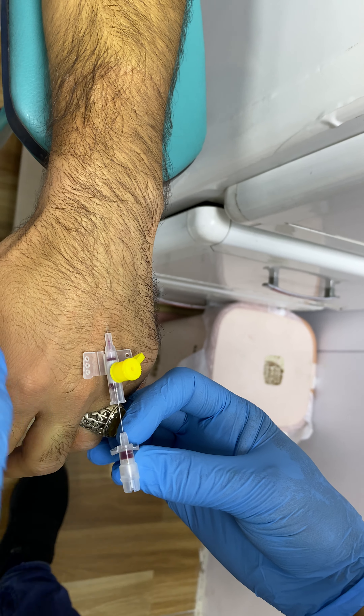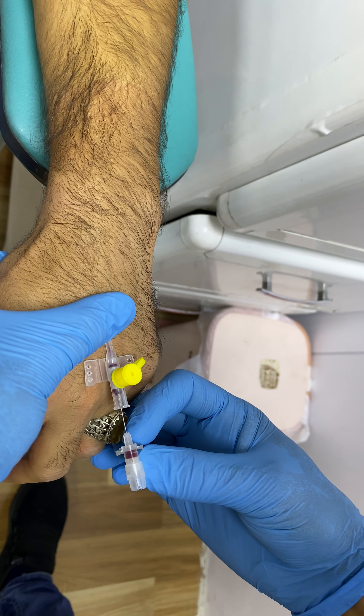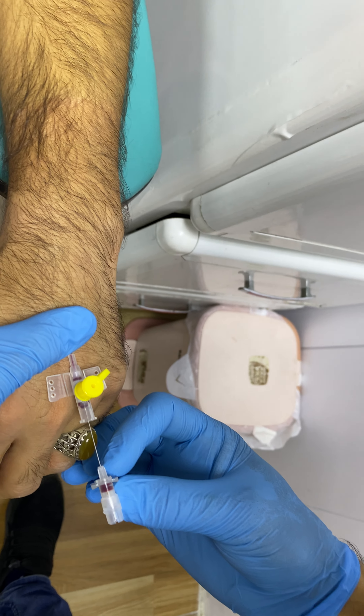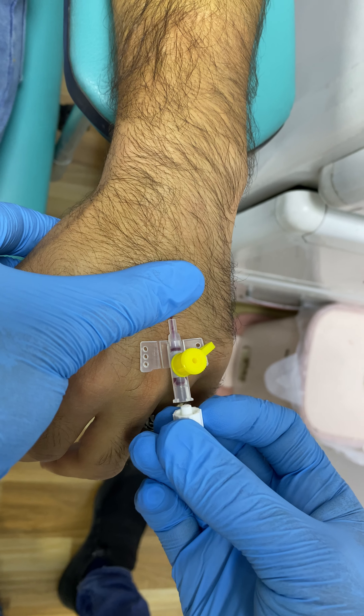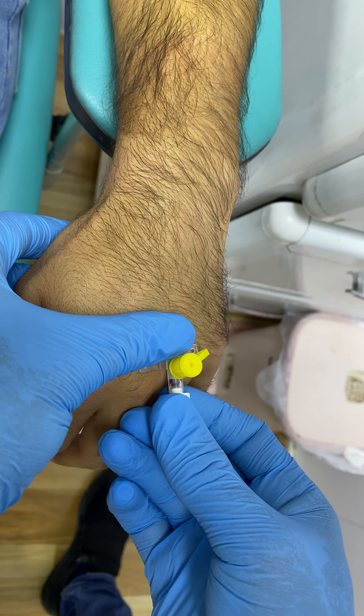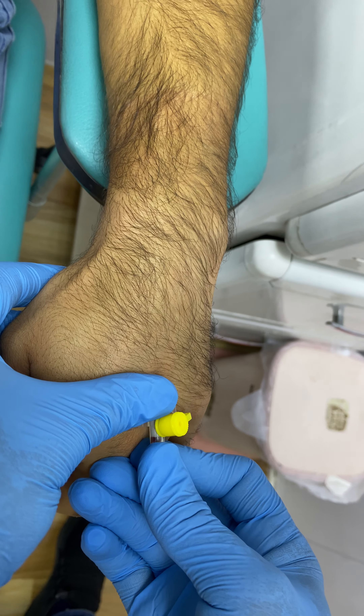It is also a good thing to do with the blood. We have to remove the blood.